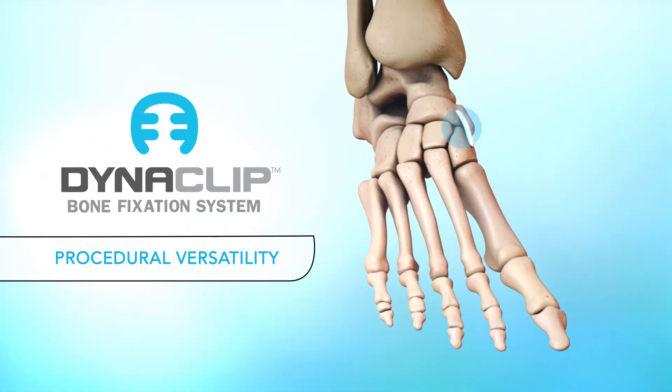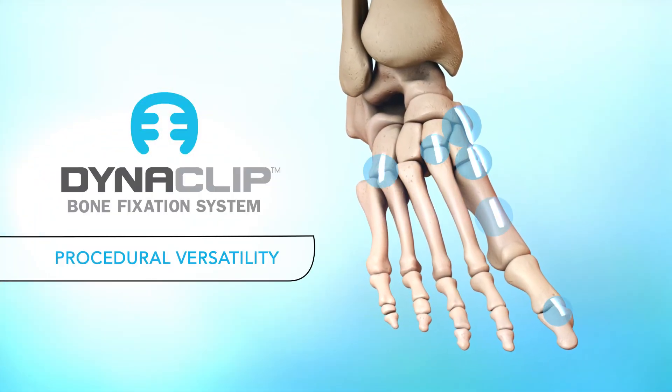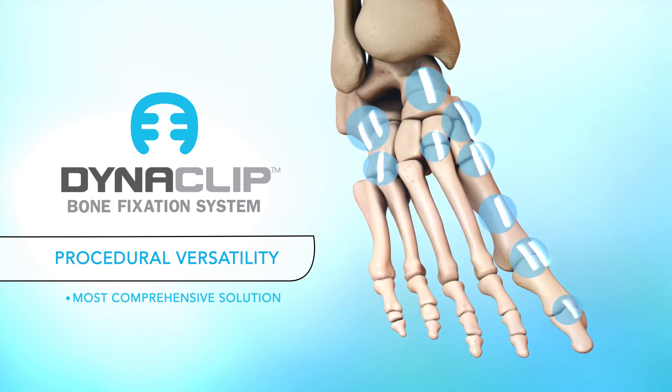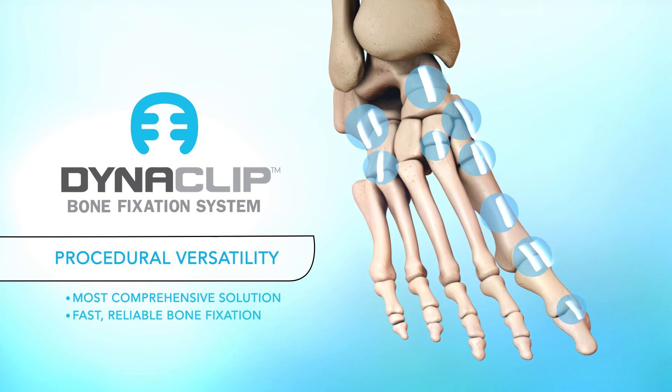Dynaclip's versatility allows it to be used in numerous joint fusion and osteotomy procedures, making it the most comprehensive compression staple solution for fast, reliable bone fixation.